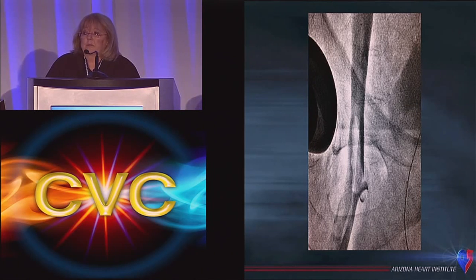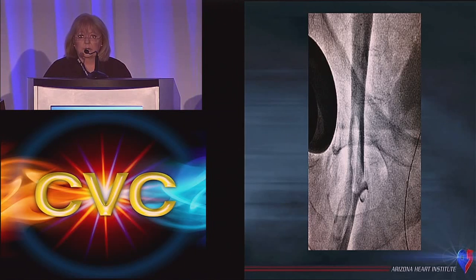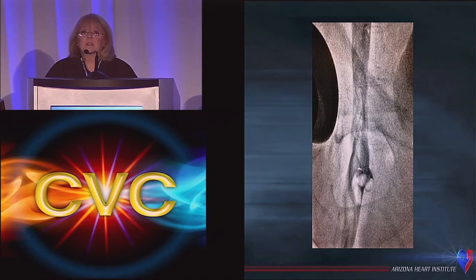That is a huge thrombus sitting there, and it was waving in the breeze. In fact, there's more thrombus up here that you can't see very well until I tried to go in with an 8 French suction catheter. And I'm thinking Trellis might not do anything to this. I don't know. I tried to suck it out, and it bunched it up. You can see it's all bunched up, and now the rest of the thrombus here is all bunched up. And it was coming out of the greater saphenous vein, and I did everything I could to pull it out and move it, because this man had a filter put in a couple years ago. I thought, well, if it breaks off, it'll just go to the filter, and then I'll go find it. So I couldn't even budge it.